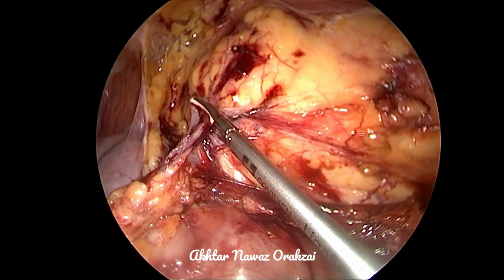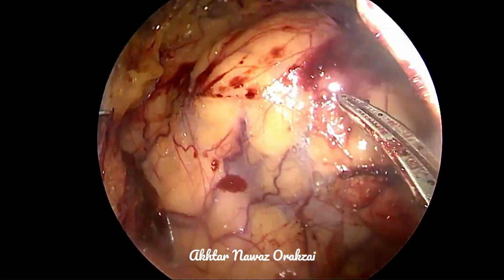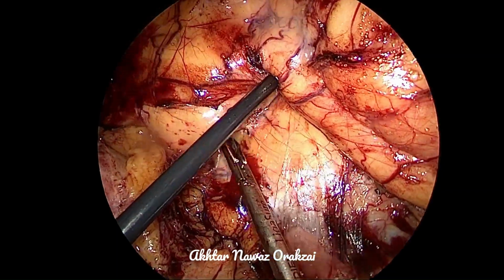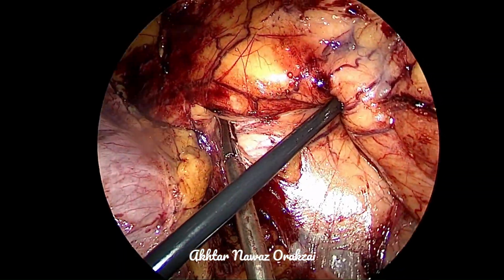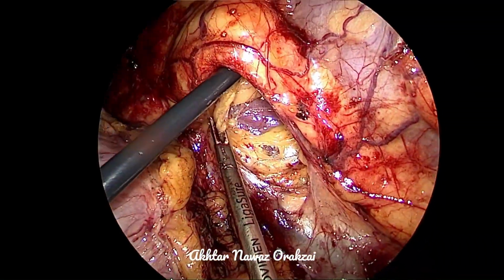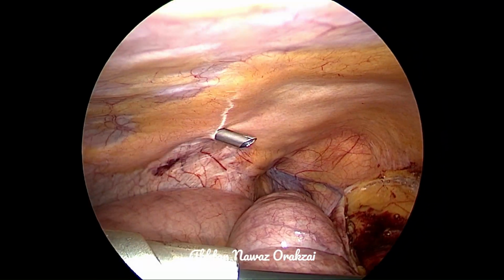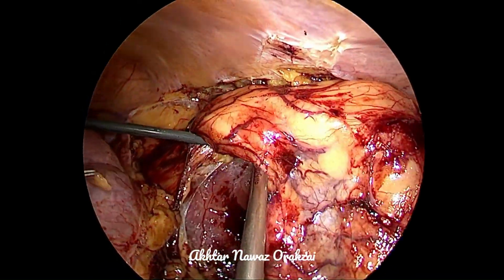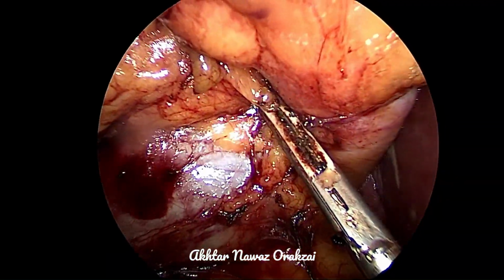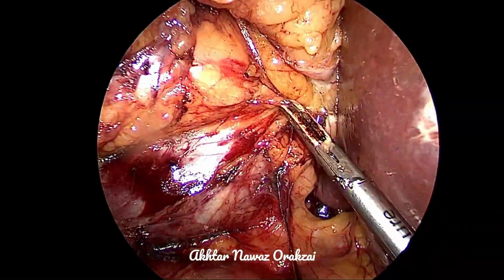Then the next steps are further mobilization of the colon. Next steps are to identify the ureter, which is lateral to the gonadal vein. Here one can see the inferior vena cava, and that's the ureter with good peristalsis, and we make a window, and then we place another port for assistance, as well as retraction of the lower pole, which will add to our dissection. And we have dissected the lower pole now, and are moving bit by bit towards the hilum of the kidney.